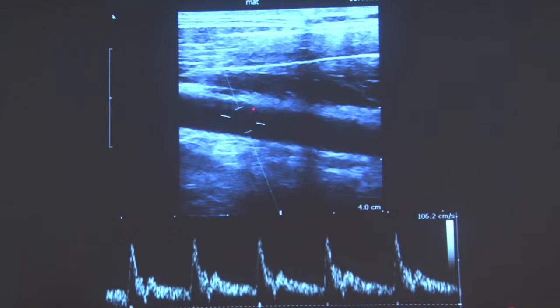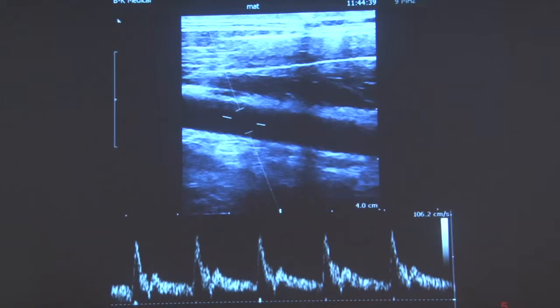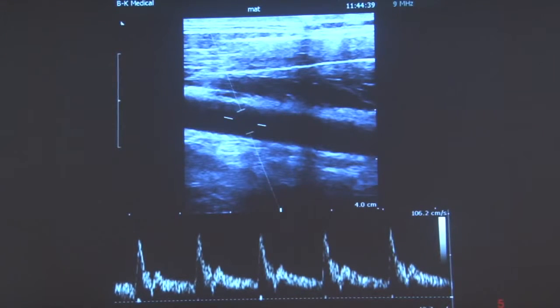So you have a range gate here, and then they use these wings to adjust for the angle, to angle compensate. And the reason they have to do that is because conventionally we can only estimate ultrasound in the direction of our wave propagation. So if we send ultrasound in this direction, we can only estimate any velocity component that is parallel to this beam. By then angle correcting here, we can get the correct velocity from our spectrum.